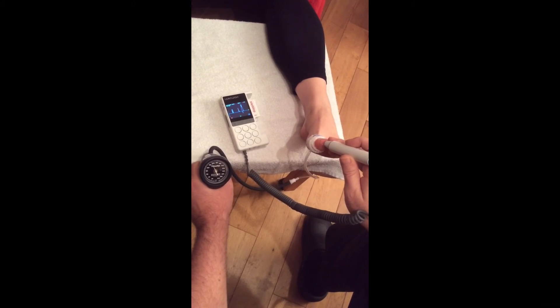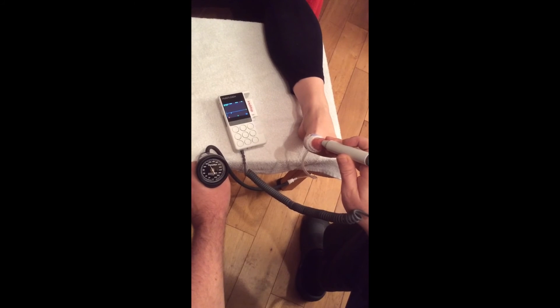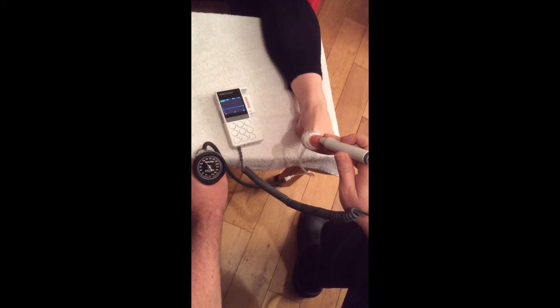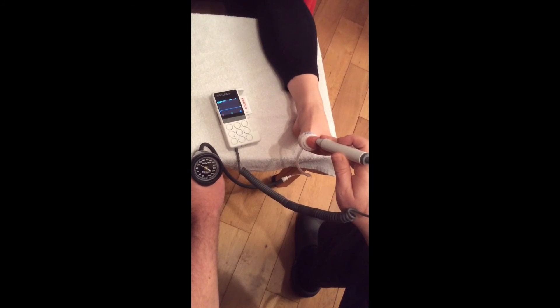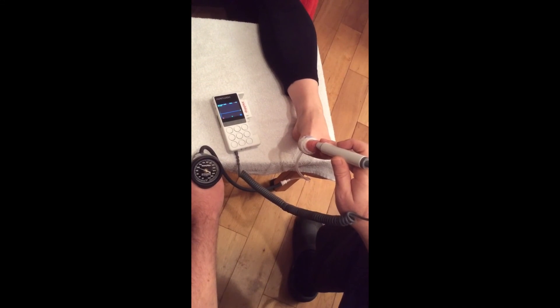Once you've located the Doppler signal, inflate the cuff until the audio disappears. Deflate slowly, waiting for the first audible return. This will indicate the toe systolic pressure.